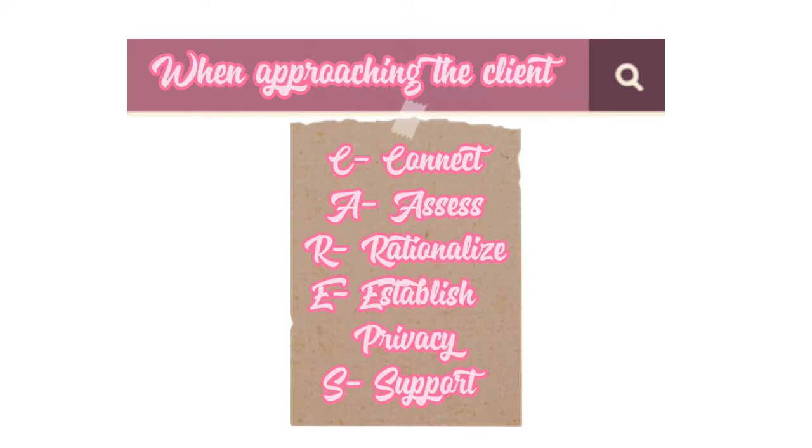When approaching the client, remember the acronym CARES. C. Connect. Introduce self and instructor to client. Identify client, read wristband and ask client to state his name. A. Assess. Make relevant assessments. Take vital signs to ensure that the client still requires the procedure, can tolerate it, and that there are no contraindications. R. Rationalize. Explain procedure to the client, including what he will feel and is expected to do.